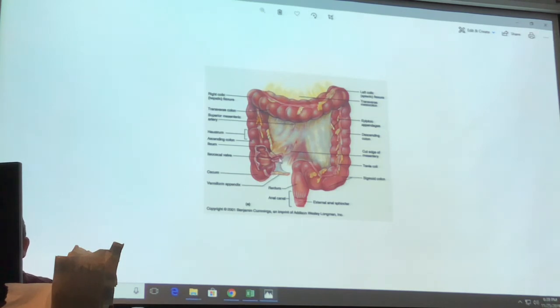Here is the joint, the ileocecal valve. So the ileum comes in here. Note there is a blind alley. The process of digestion we would expect to occur and flow this way, but there is a blind alley where material could go the other way. This area is called the cecum, and at the cecum is the appendix. This area is filled with a large amount of bacteria, flora that are important, they're vital to our overall biochemistry.